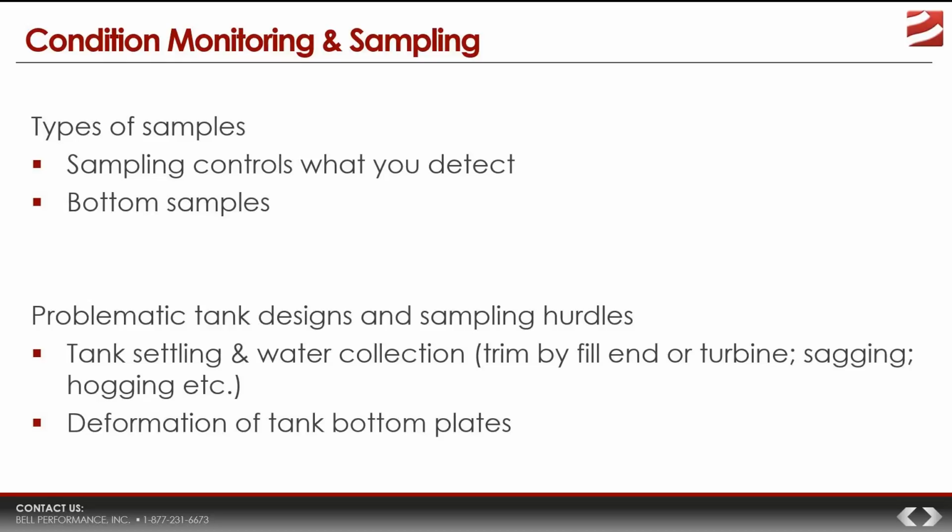Now, why is that? Well, they're convenient. It's easy to get a sample from that. It's also fast. You don't really have to do any work. The dispenser's there, boom, you can get whatever sample you want. It's fast and it's easy, and it gives us a fuel sample that is perfect for fuel quality sampling. But there's a distinction here. It's perfect for fuel quality sampling, or samples that are going to be used in fuel quality testing. But it's not perfect for microbiological testing, and there's a difference between the two.